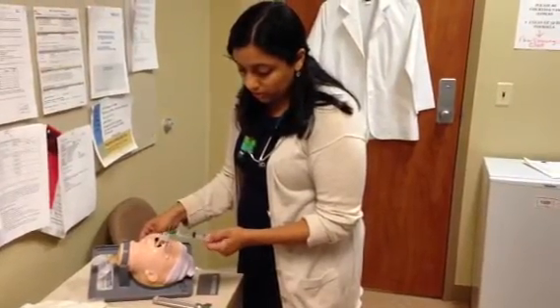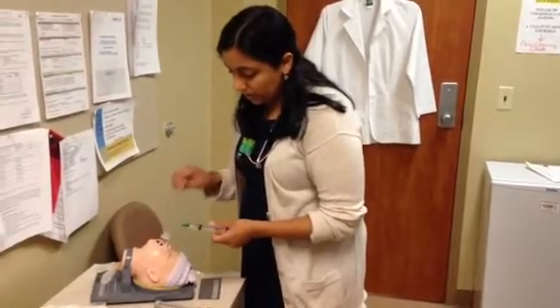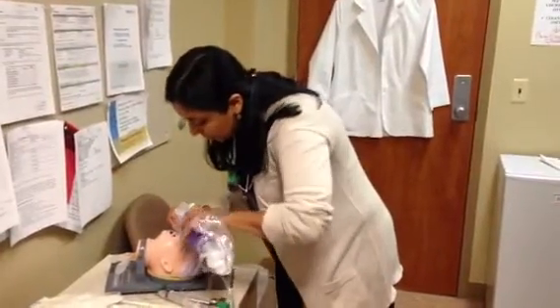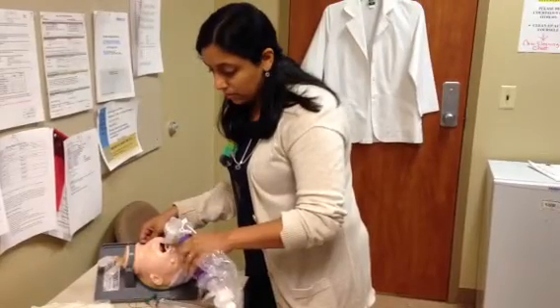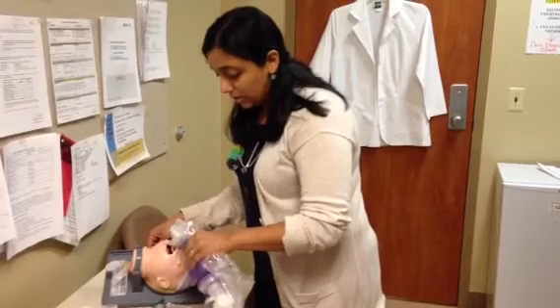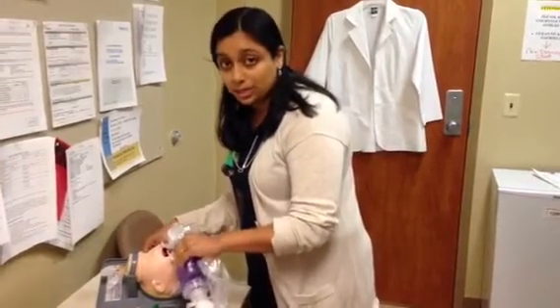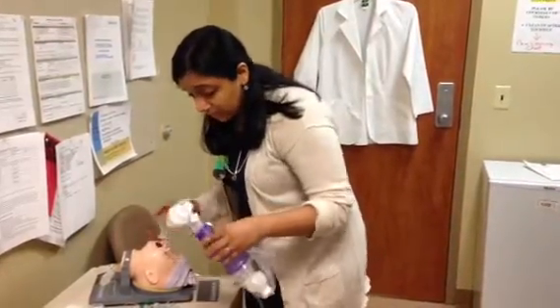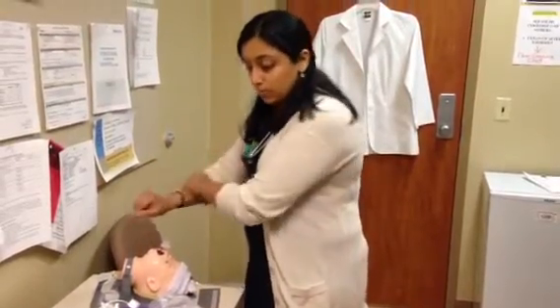We're going to push very quickly from 6 mLs down to 3 mLs, insert half the dose, remove the NG tube, and then end up bagging that surfactant into the infant's lungs. And during this whole process, the infant needs to remain right side up. So you're going to bag the surfactant into the infant, and you want to bag for at least 15 seconds to ensure that all the surfactant has cleared the ET tube and is into the infant's lungs. Once that's done, and you may see that whitish surfactant fluid in the ET tube as you're bagging it through.